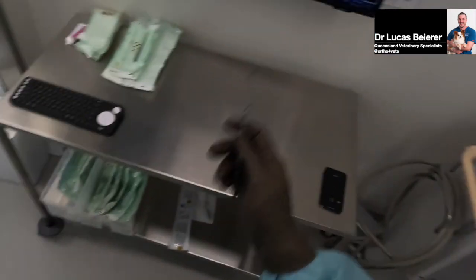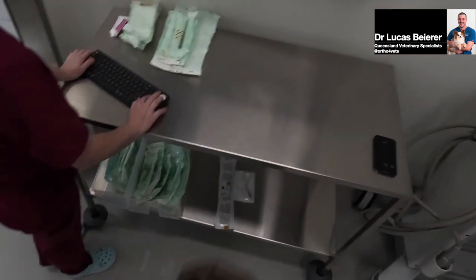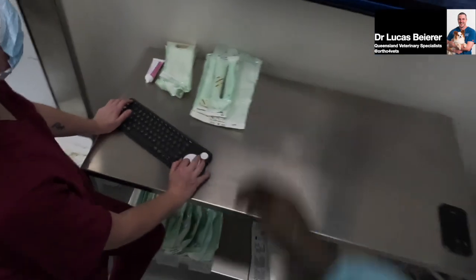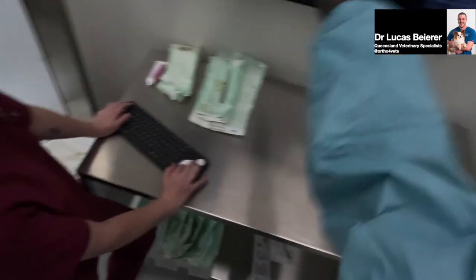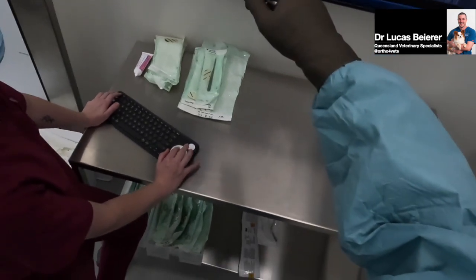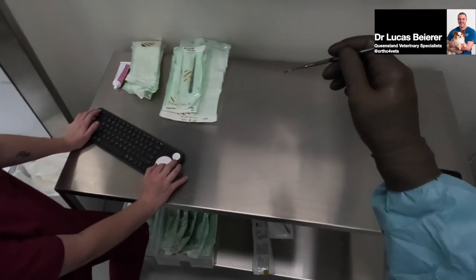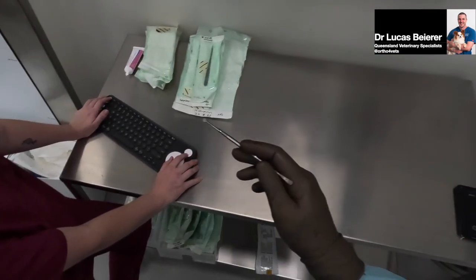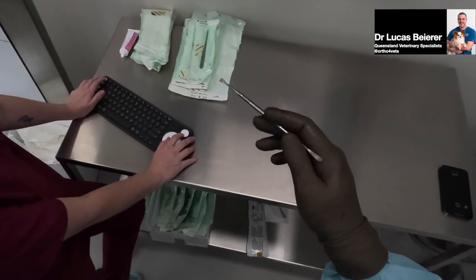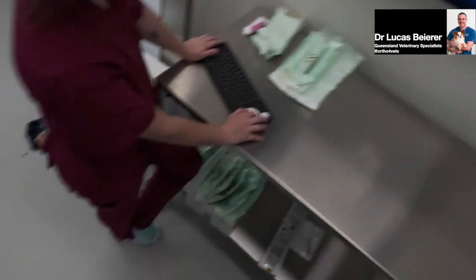Can we see the other views without the templating? Even if you drag that image into the middle, so the words are useless, so we drag that image. Yeah, there's nothing useful. Can we see the cranial caudal of that one? Of the broken leg, the left leg? Okay, thank you.